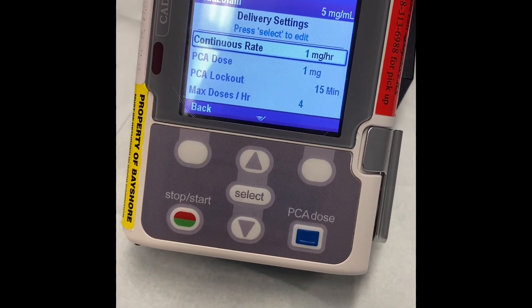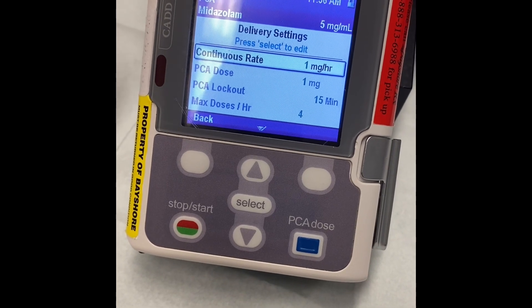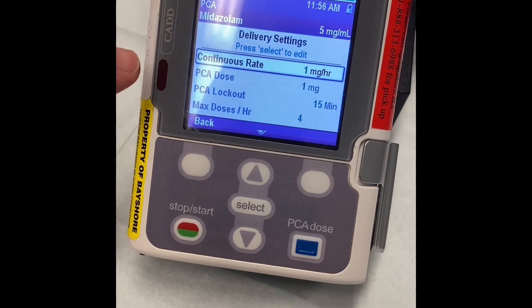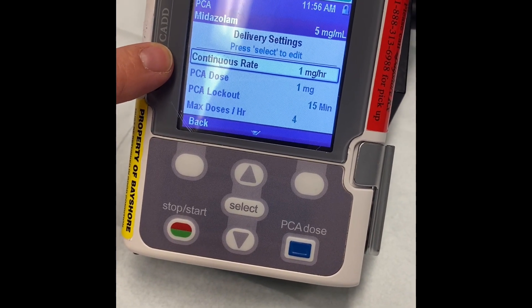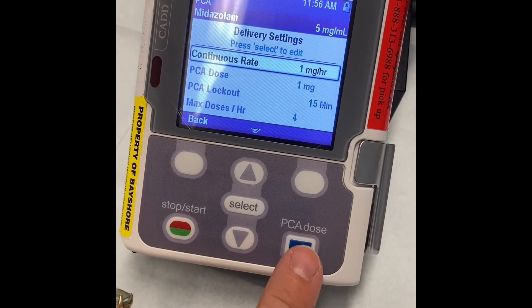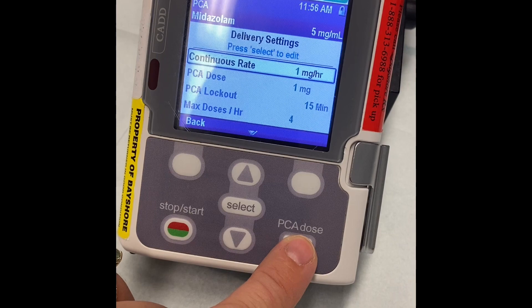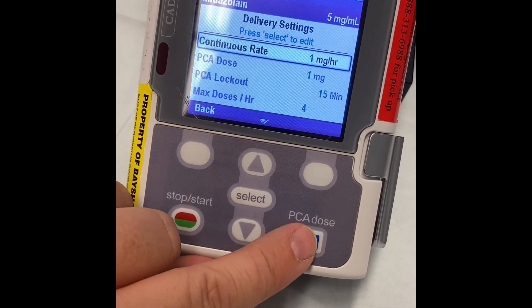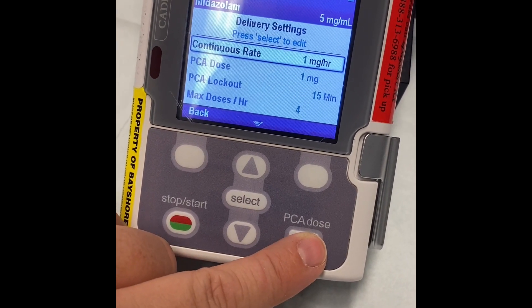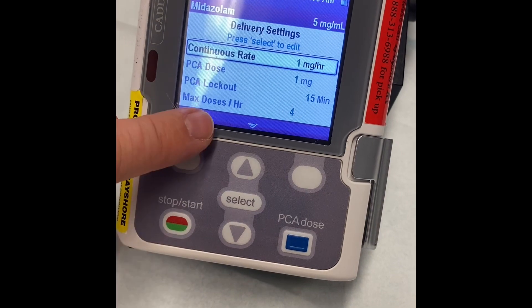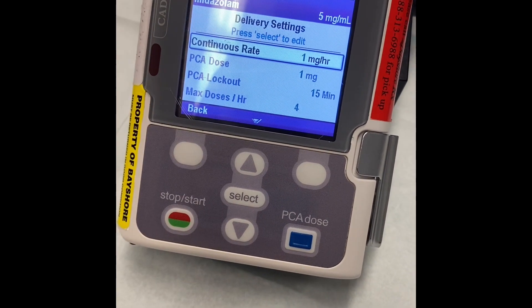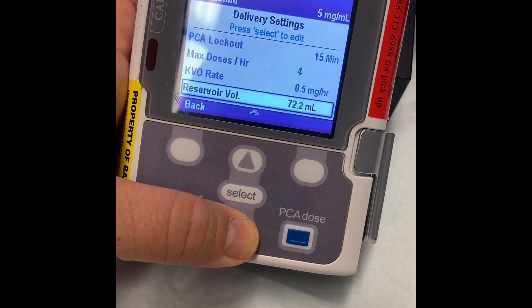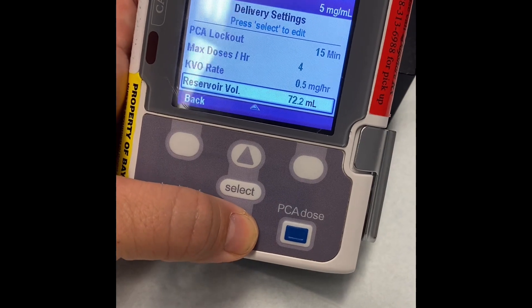You should be double checking this with your medication bag as well as with the physician's orders. The continuous rate is 1 milligram per hour. The dose — if the patient, the family, or yourself press the PCA dose button — will be 1 milligram. The lockout is after 15 minutes, so you cannot press this again within the first 15 minutes, and you can do this only four times per hour. You should not be changing this; this is just you double checking. And there's your reservoir volume again.